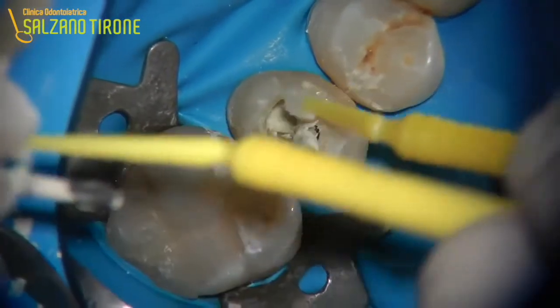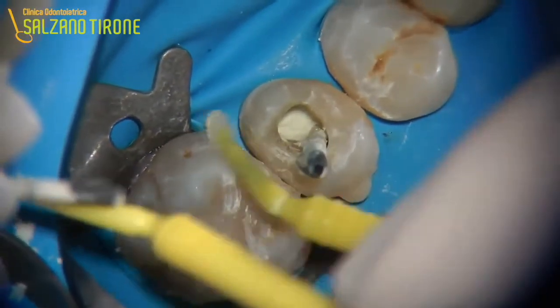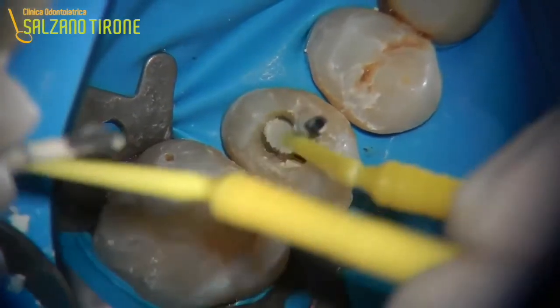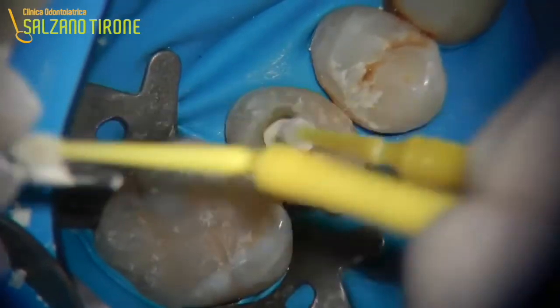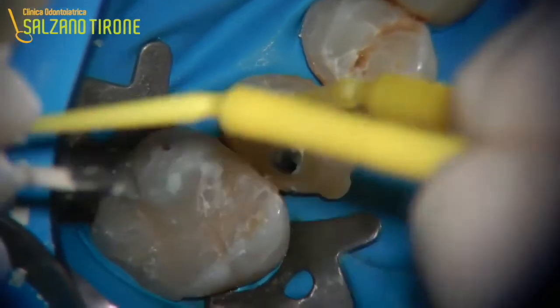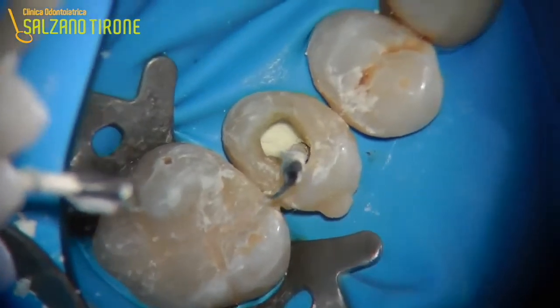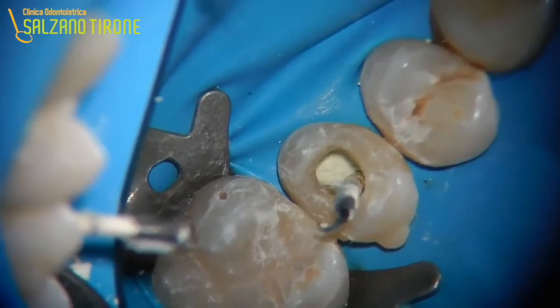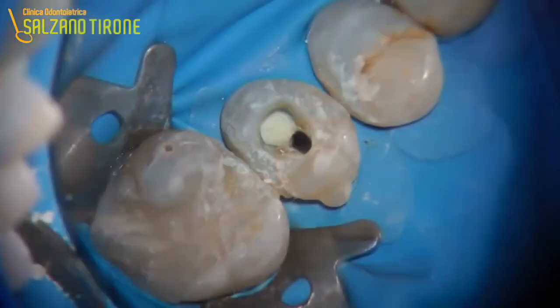Anyways, the patients on which I make these interventions are always asymptomatic after this procedure. It's nothing traumatic or worrying. Here you can see that the MTA is compact. At this stage I remove the paper cone, as I said before, and that's the end of the first session. During the second session we'll finish the root canal treatment by inserting a thermophil in the canal you can see here.